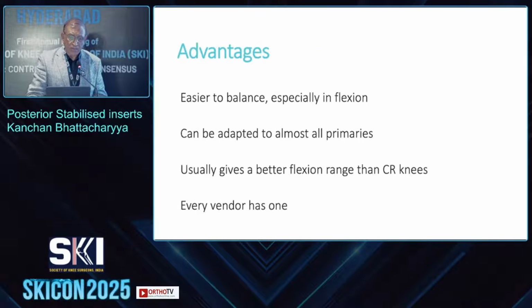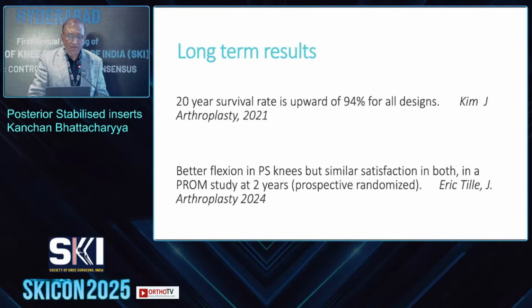Advantages are it's easier to balance, can be adapted to almost all primaries, usually gives better flexion. Every vendor has one. Long-term results are pretty much the same for CR and PS, and though PS may have a little bit more flexion, the satisfaction index remains the same.